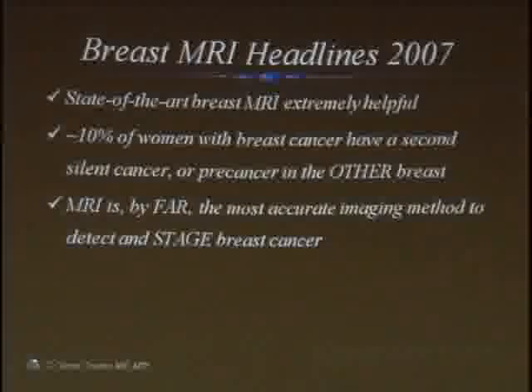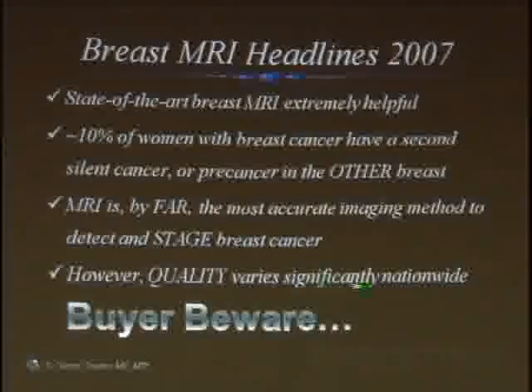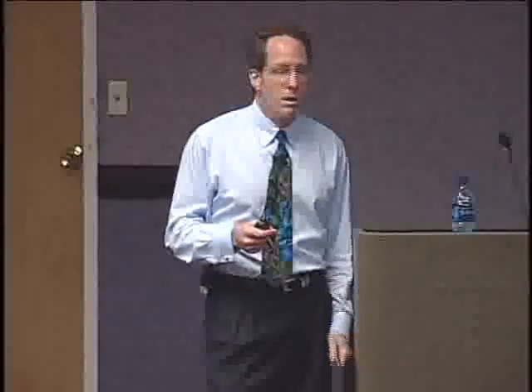MRI is by far the most accurate imaging method to stage breast cancer. However, quality varies significantly nationwide. This was the first time I had ever seen in our peer-reviewed journals people talking about quality like this. They were warning people. It was a big red flag saying, guess what? Lots of people do breast MRI, but you shouldn't be ordering it from them, without actually saying it. So the statistics, if you follow this early statistic of breast MRIs, we were terrible.